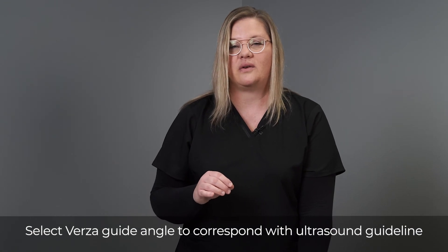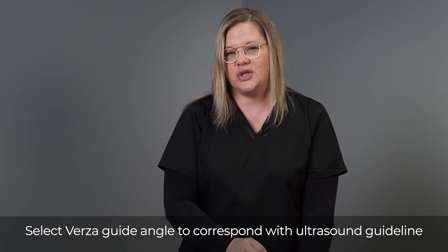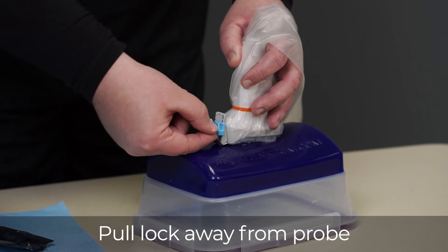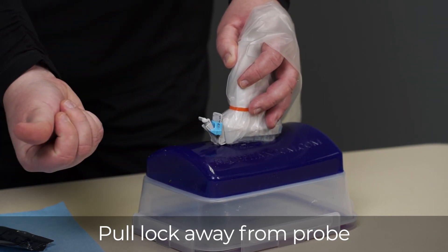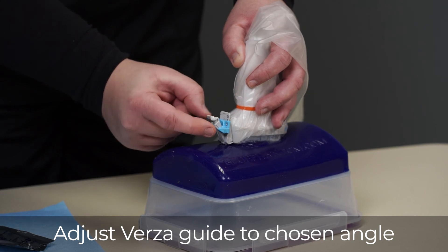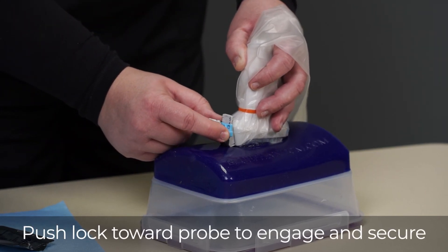You'll look at your ultrasound system to make sure the target is within one of the biopsy lines. Once you have identified the correct pathway on your ultrasound system, choose the corresponding number on the Versa guide. To do that, make sure the lock is pulled out away from the probe. We have selected angle three — line up the correct number and engage the lock by sliding it in.